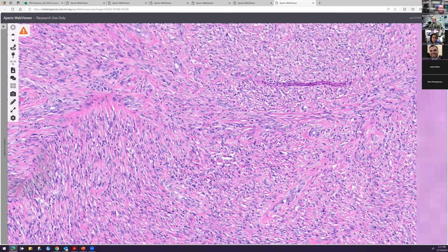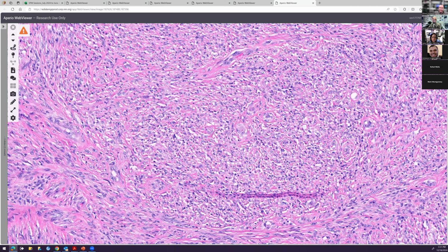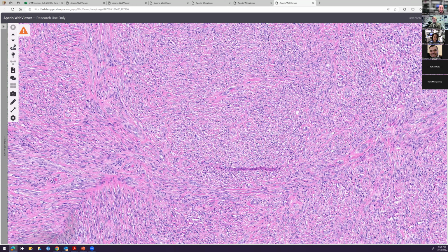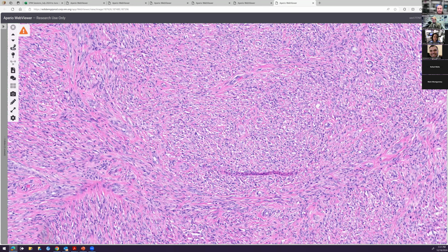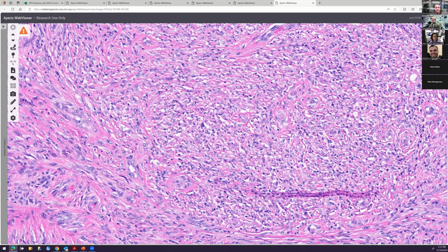But then how do you get to liposarcoma here? How would you even call it a liposarcoma? That's tough with just this, right? And you can't really see that, because they all look fairly similar. But consider, obviously, I think this was a retroperitoneal mass, right? So if biopsy, you want to be a little careful and have a high suspicion of that.